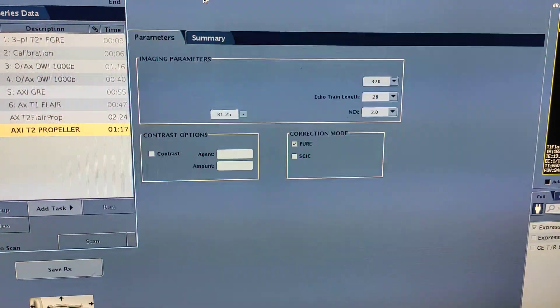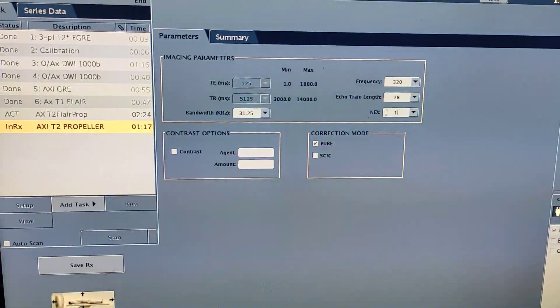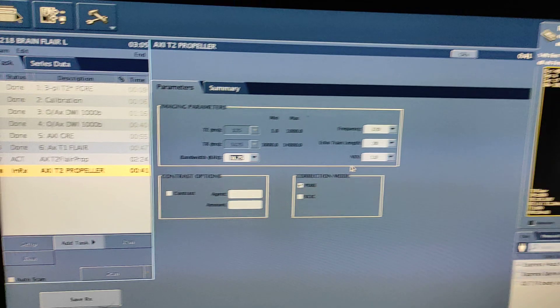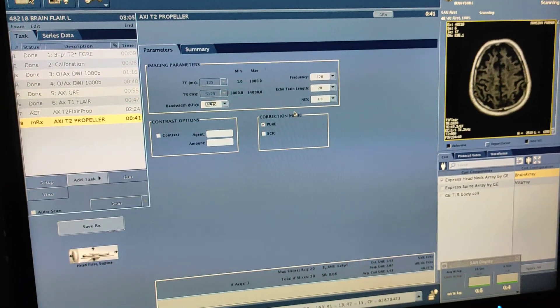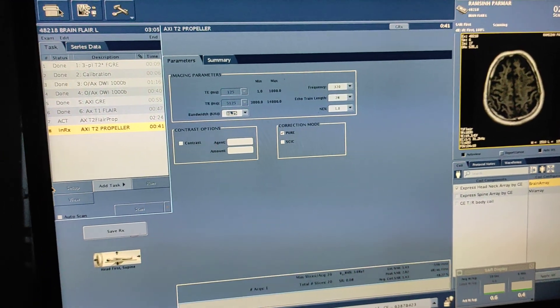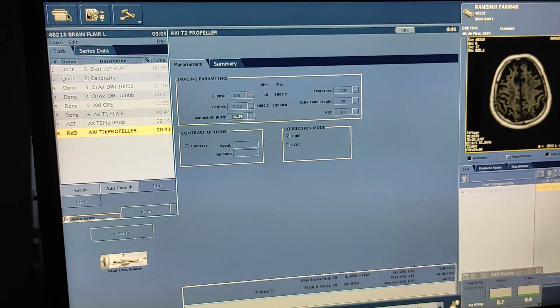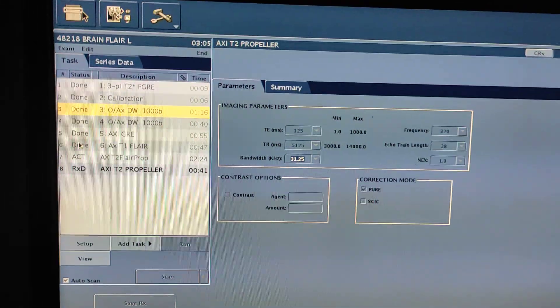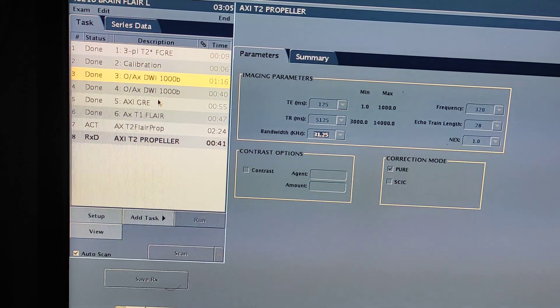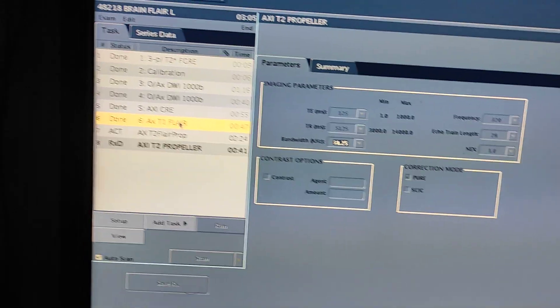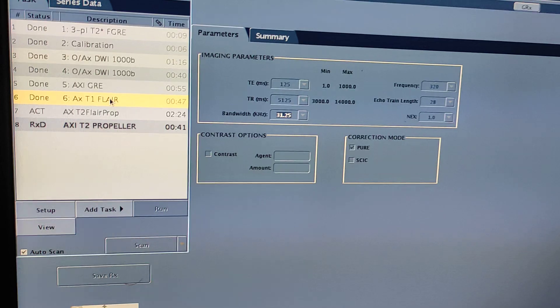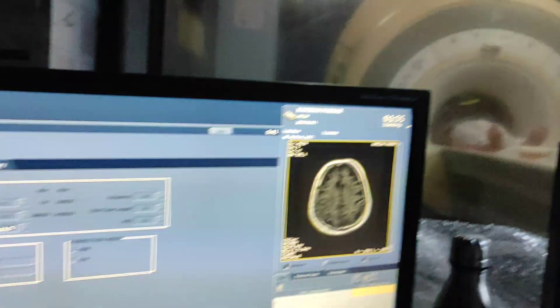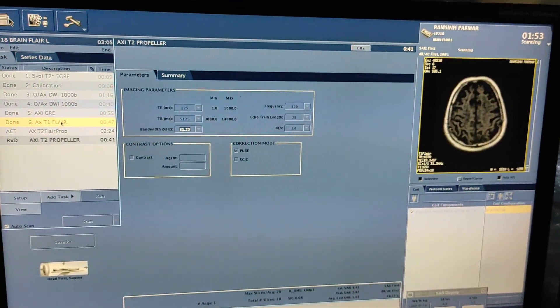I am reducing the time because my system is good. For good quality image with less time, I have taken fast DWI, fast GRE, and fast T1 FLAIR sequence because patient is rowdy and not giving proper position. Age of the patient is 70.